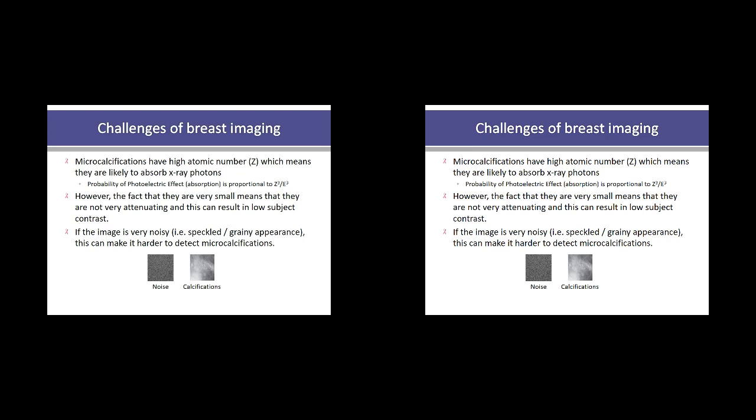So not only is the resolution an issue, the contrast is an issue, and the noise within the image is an issue as well. So it's all three image quality parameters that have to be really good in mammography. Now, obviously, this is just noise within a piece of perspex, but that's that sort of speckly appearance. And I'm sure you can imagine that if you're trying to look for little white specks like this, and this is your background, it's going to be very, very hard to detect them.